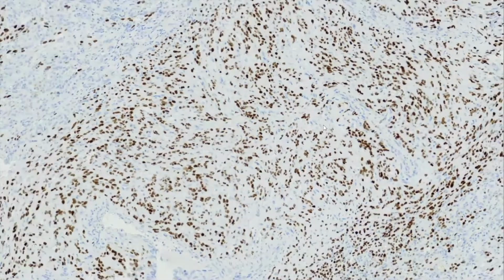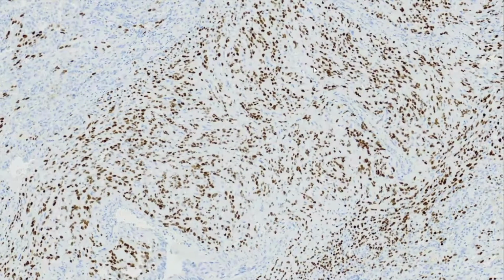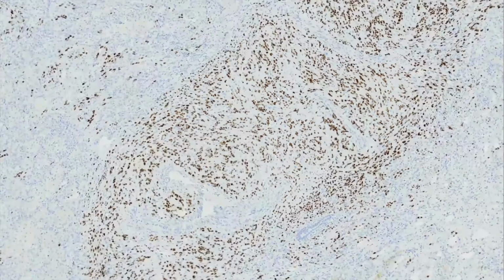So this is an immunohistochemical stain for HHV8, which is positive in Kaposi sarcoma. And so these cases are classically associated with HIV, in which they develop, and or other immunodeficiency states.